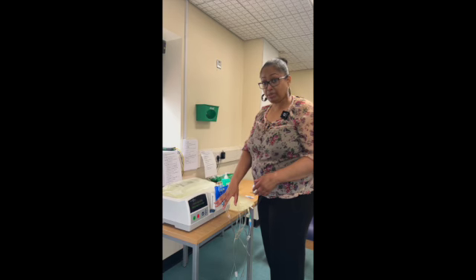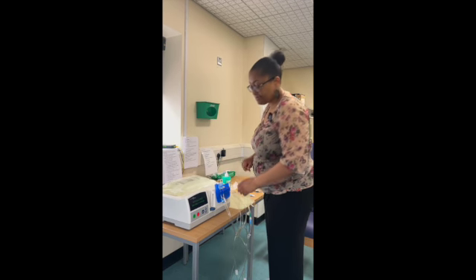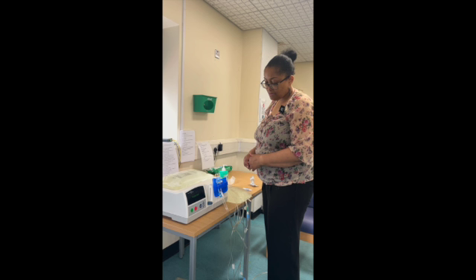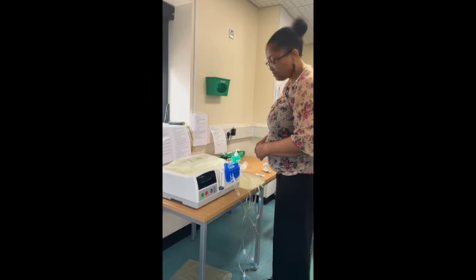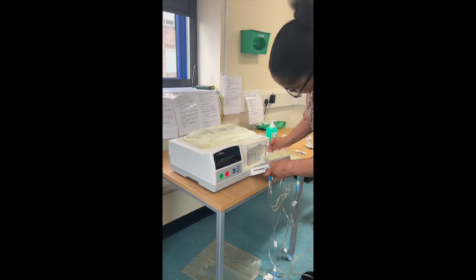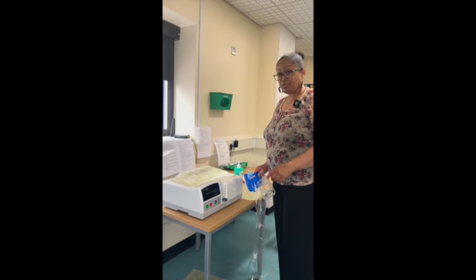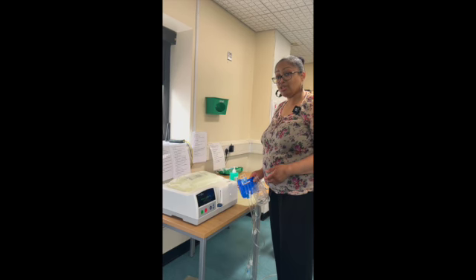So I'm going to press the green button, and then this will then tell me that I can remove the cassette from the machine. I'm now going to press the green button again, and then this will send all the information from my dialysis session to my dialysis unit.